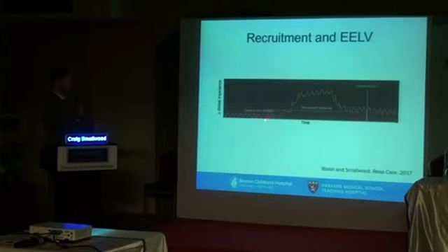What we want to see is this. It's greater than where we started. And so this would be the global improvement in end expiratory lung volume, which is a surrogate for FRC. Increased FRC means reduction of collapse, and hopefully VQ matching that will improve oxygenation, improve ventilation, and allow us to get by with lowering our tidal volume, these settings that are injurious to our subjects.